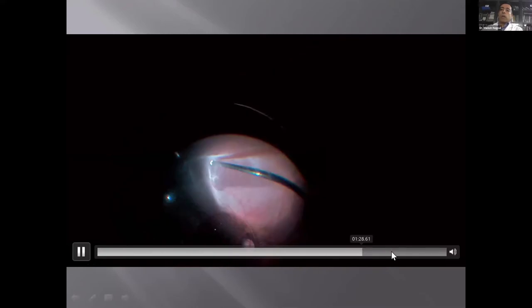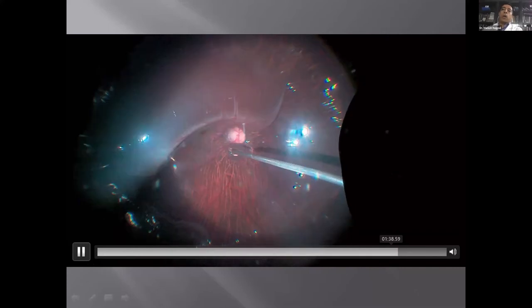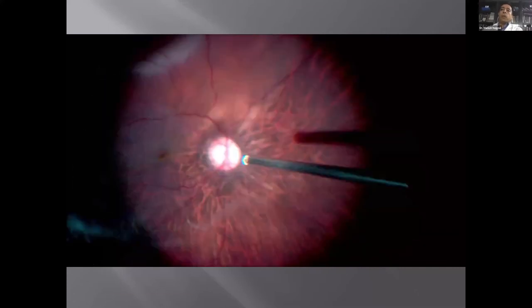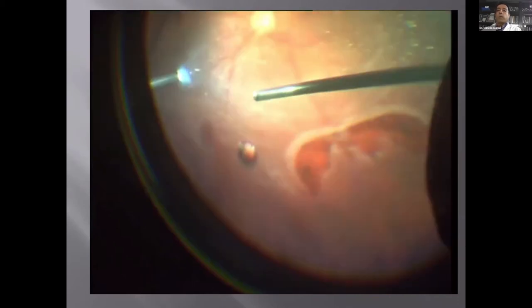Vitreous removal is the most crucial part of detachment surgery, especially where the hyaloid is still attached. Once the hyaloid is detached, you have a freely mobile vitreous that you can remove and go to the periphery. The key is visualization — whatever system you use, contact or non-contact. I personally prefer contact visualization. Here is a typical detachment with a large tear with rolled edges. We ensure good view, zooming in to see the vitreous-retina interface and remove vitreous without touching the retina as far as possible.